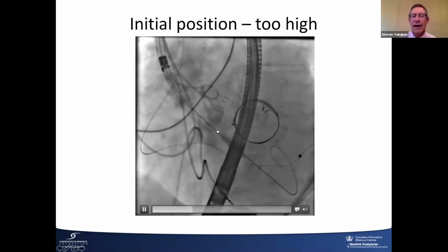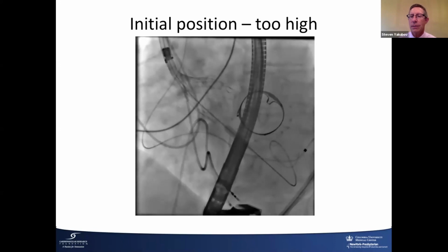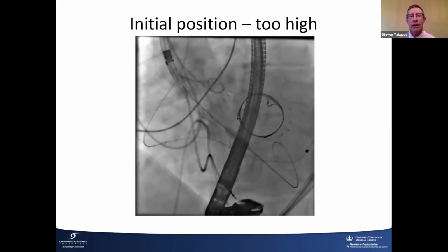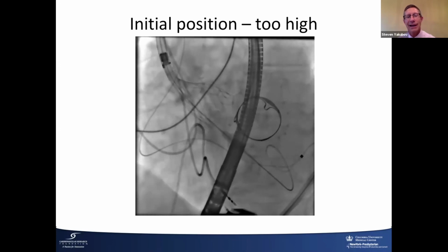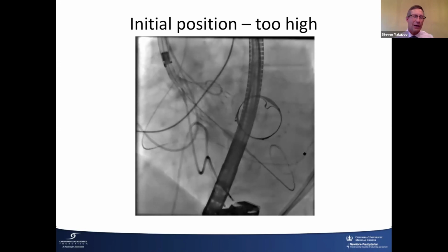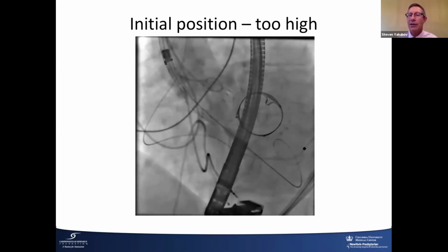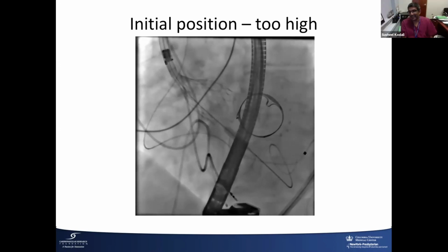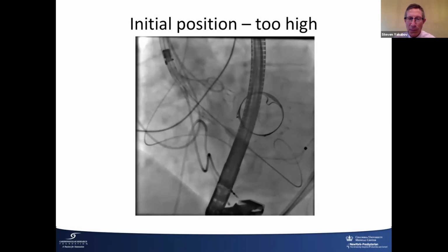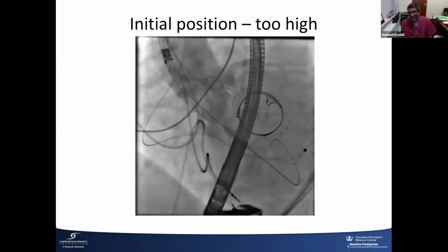I like your strategy, Sushil. You already have a pacemaker in place. You have nothing to lose. You're trying to prevent PVL. You're going to get a great gradient no matter where you are here. I was also intrigued that we've talked about deploying in an LAO view, cusp overlap in the RAO, and you're deploying off of a mitral annular ring. Right, that's what I wanted to say. That's a case report. Your pigtail's somewhere in the aorta. You use it for the deployment. It's really an interesting technique.